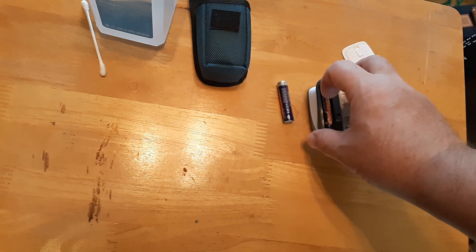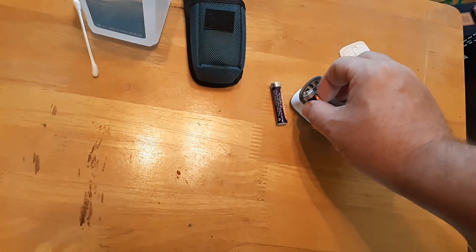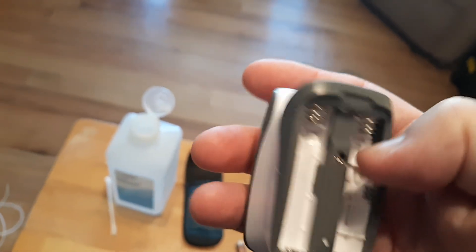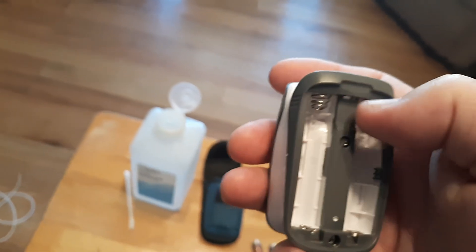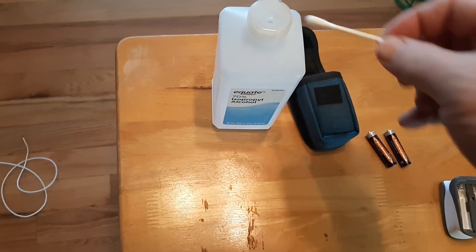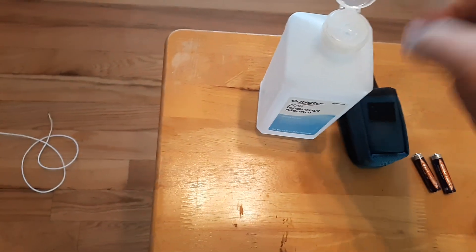A lot of times if you don't use your oximeter for months and sometimes years, these battery terminals inside will start corroding. You might not even be able to visibly see the corrosion on there, but a lot of times it will be there. So what I want you to do is get a drop of rubbing alcohol.